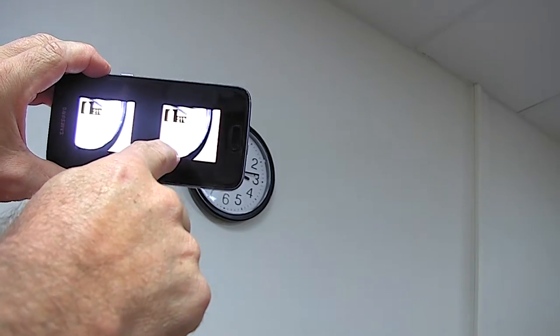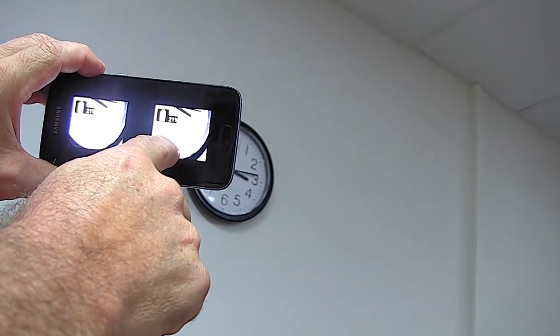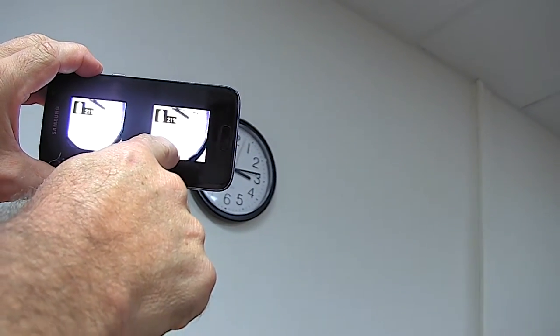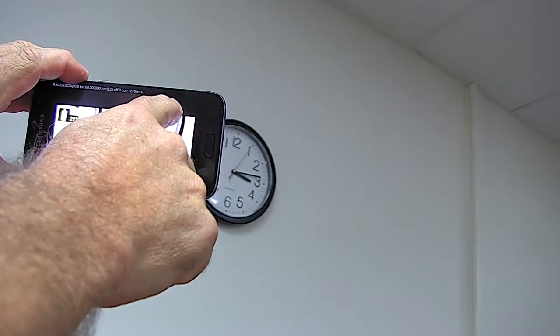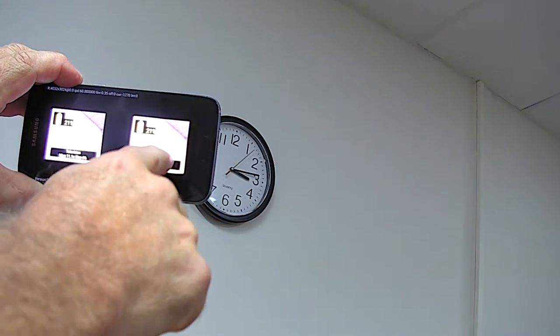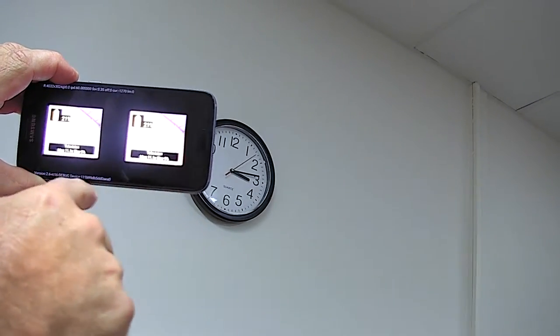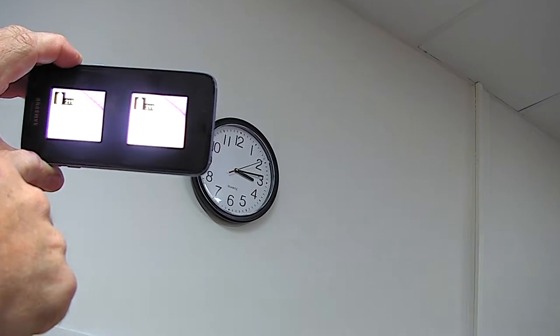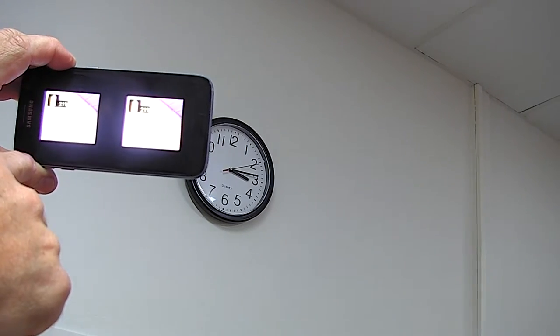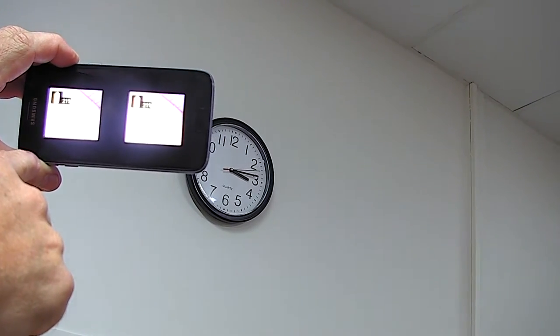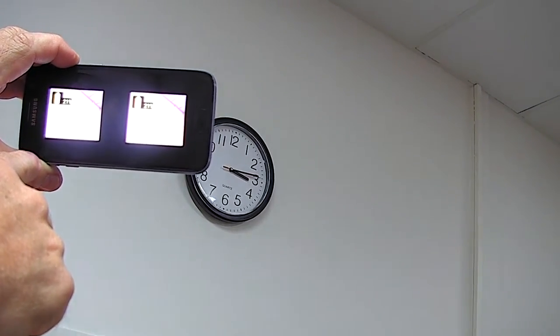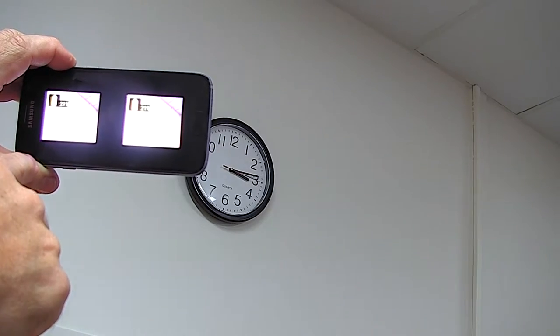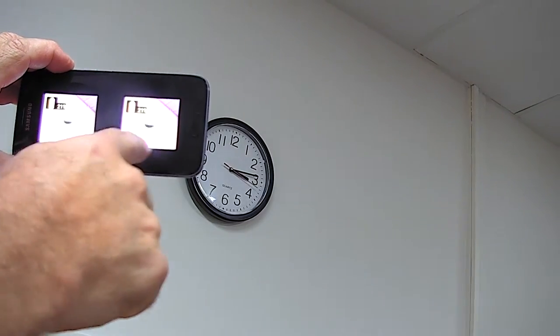We can also demonstrate the bubble effect here. I swipe the other way and as you may be able to see, I've now created a small bubble that magnifies just a very small part of the field of view, with the rest of the field unmagnified.